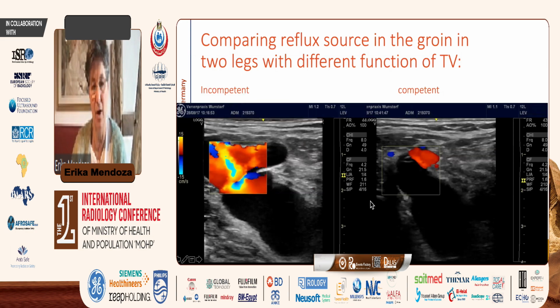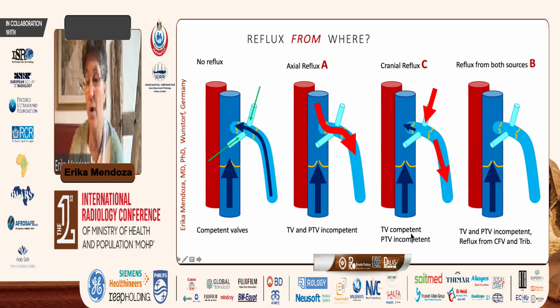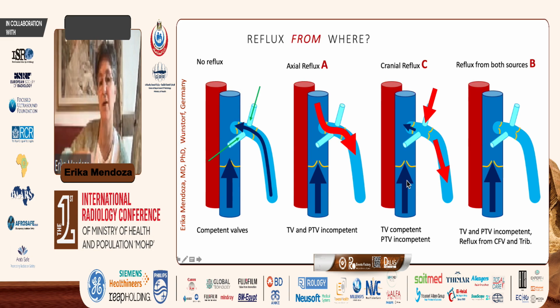This is, again, a comparison. Normally, those with an axial reflux have larger refluxes and larger varicose veins than if it is the tributary. So now we have seen from where the reflux can come, and then we have to see to where it drains. It can be axial, it can be cranial, or it can be from both sources.